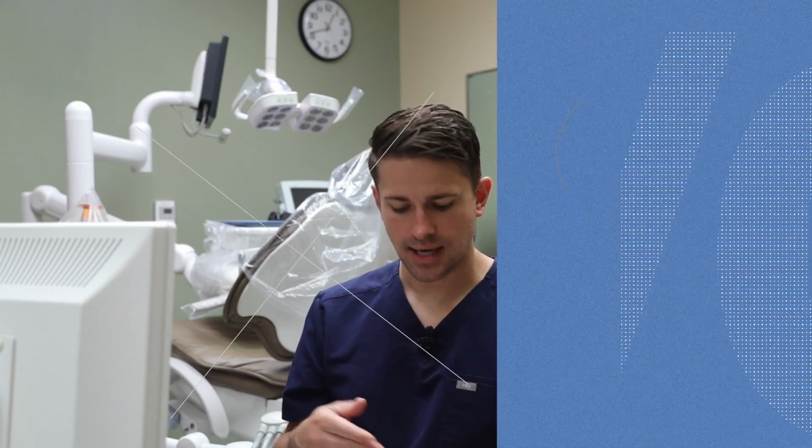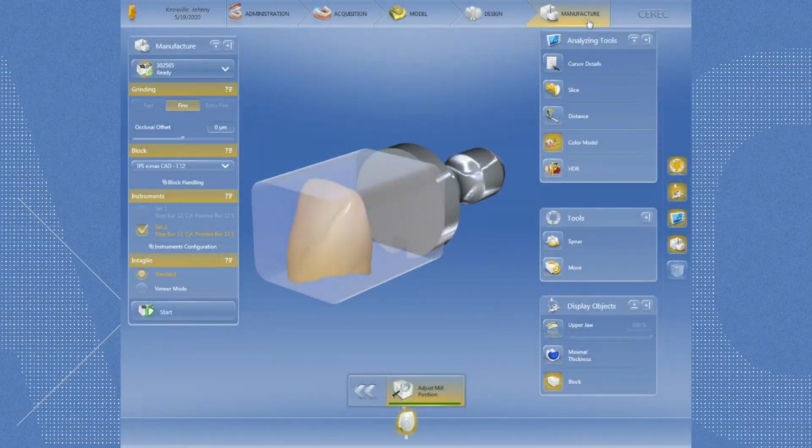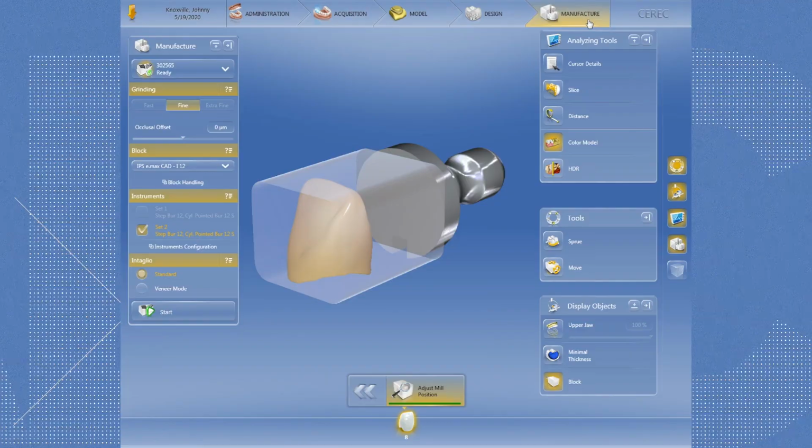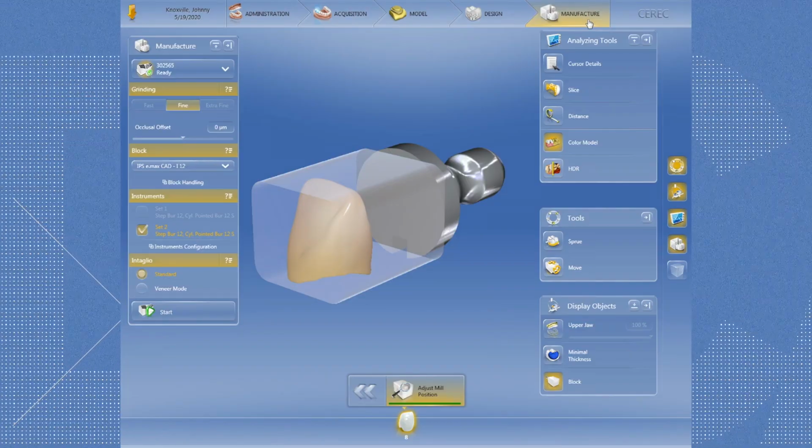And what's nice is I can mill out the exact same crown, so it's going to have the same contours, the same size. It's going to look identical for all of the different crowns I mill out. The only difference is going to be the shade. I'm going to have different shades of the same crown. So that's what I'm currently working on. I have 3 shades currently that I have done, and I thought I would walk you through the process for this. I've kind of already told you about what I've done on the Cerec side of things.